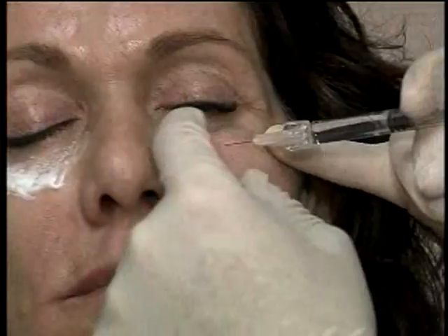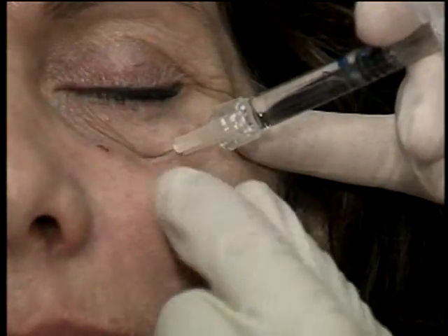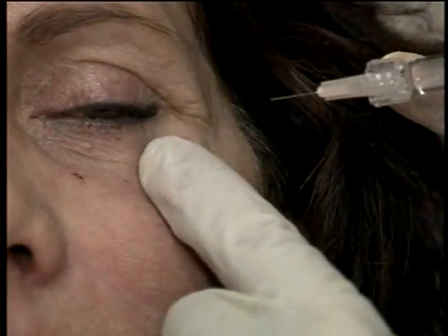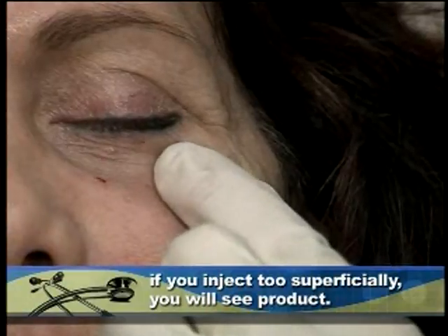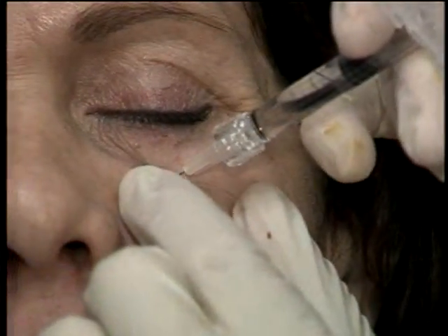I'm going to turn your head back this way. I'm going to fill in this area a little bit more right here. All right, once again, you want to make sure you're not superficial, because if you get too superficial with this, you will for sure see it. Massage a little bit. I think I use a little bit more right there.